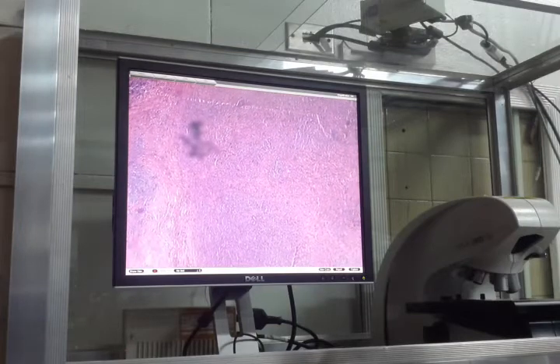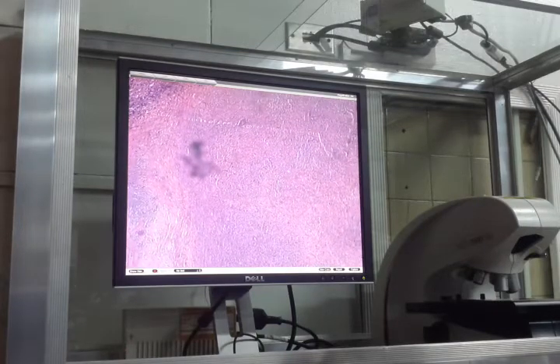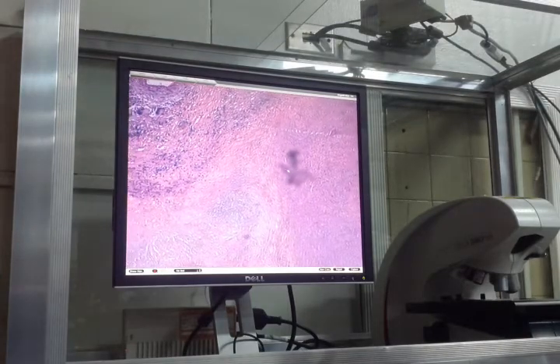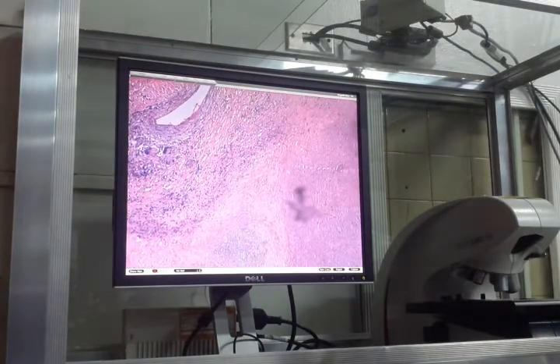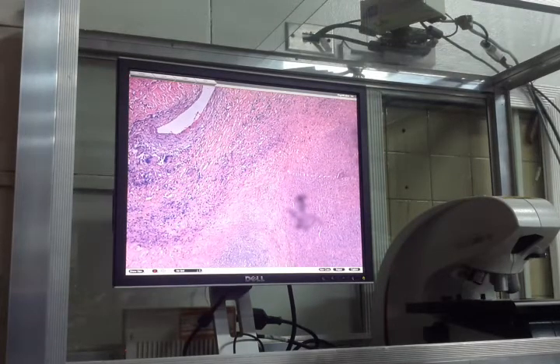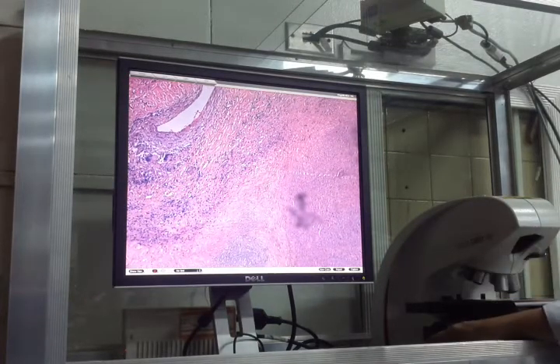Caseous necrosis can have blood, RBCs. Then, what do you see here, very near the caseous necrosis? These are epithelioid histiocytes, what you see here, and these are lymphocytic infiltrates rimming the lesion, okay?